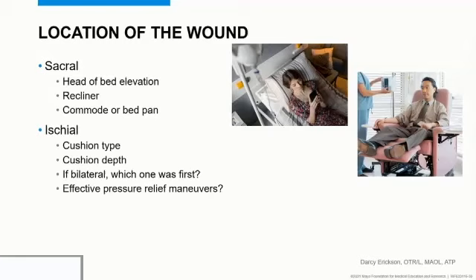And I think you see that when people are doing their anatomical measures, but then maybe are not familiar with how much that backrest hardware is going to eat out of the seat depth. And so what may have been an appropriate seat depth cushion if you were just going to sit on it doesn't work when you have 3 inches of the back taking up that space, and now you've got all that distal thigh hanging off the front edge. And we know when legs hang off the front edge of the cushion, they also go east-west instead of staying north-south.